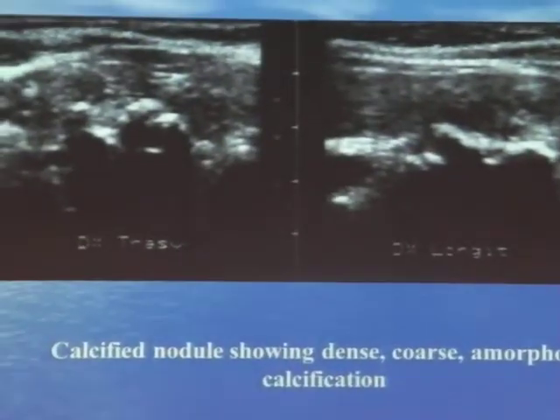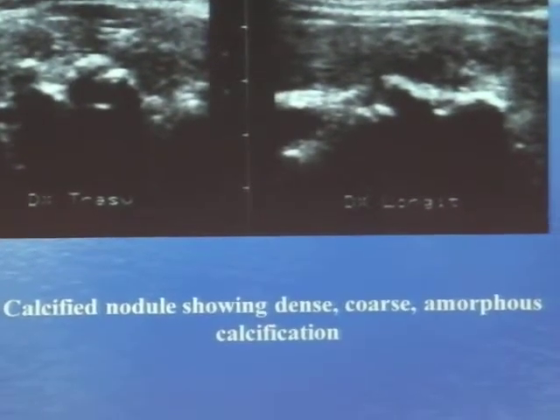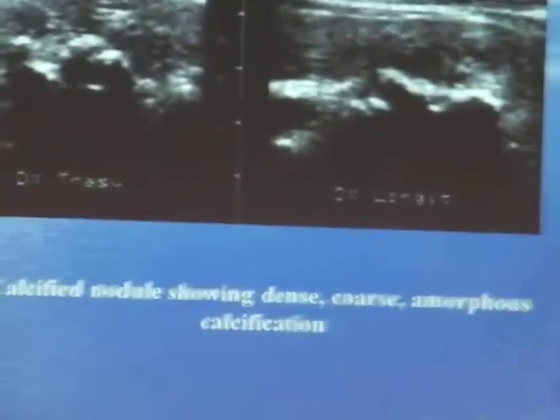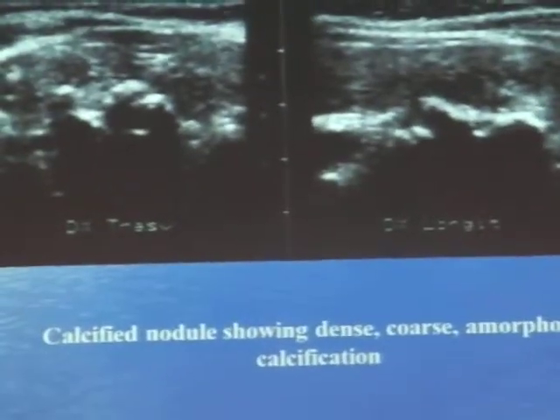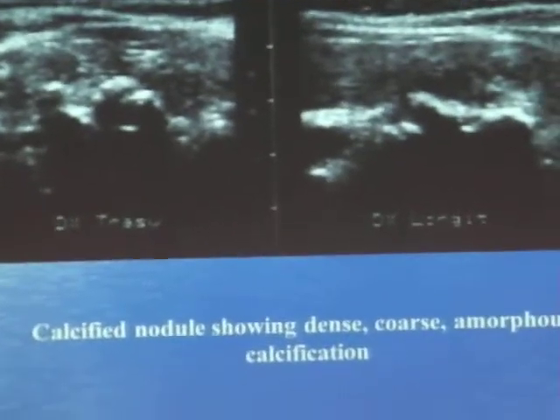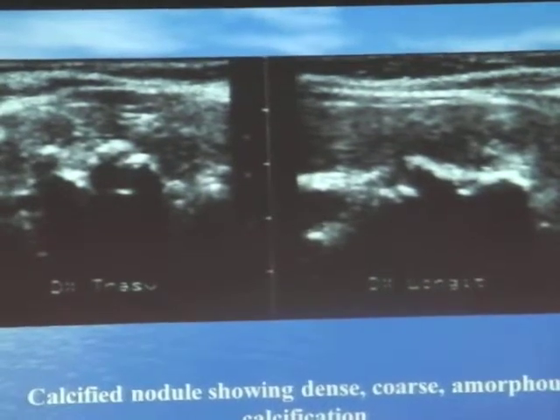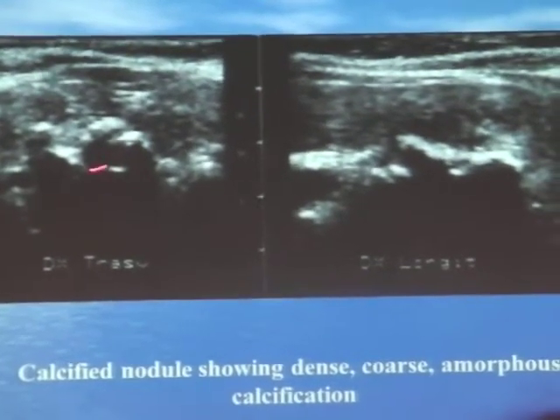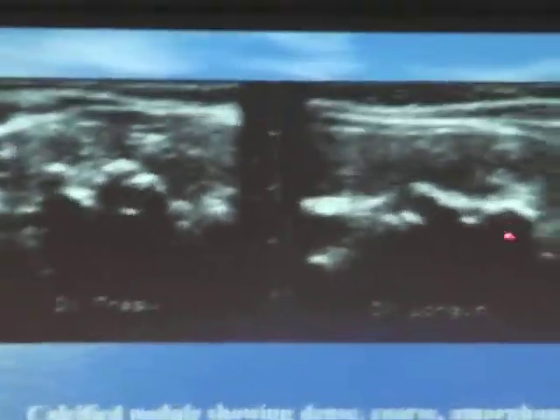Okay. So what happens in the multinodular goiter, and what is the calcification that appears in a multinodular goiter? The multinodular goiter calcification is amorphous, very thick calcification, or an annular calcification, which means surrounding the nodule itself. So with this sort of calcification, now I know it's a little bit difficult for you, you see nothing at the back here, and I will give you an explanation for this.